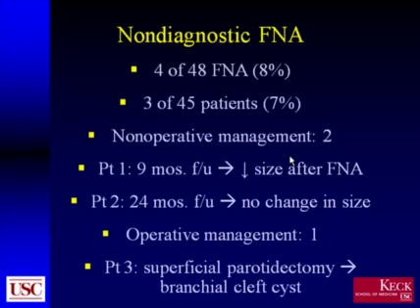The second patient was followed for 24 months, and this was a small lesion that showed no change. One patient did undergo operative management, and that was the patient who underwent superficial parotidectomy for a branchial cleft cyst.